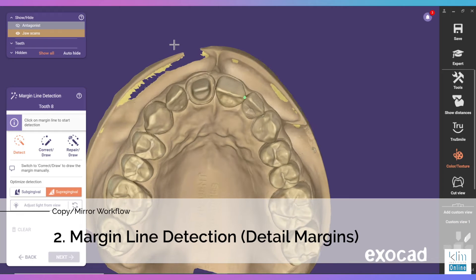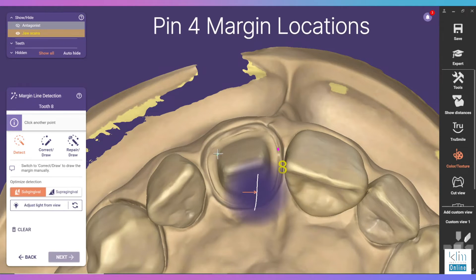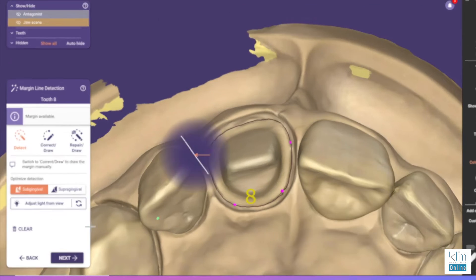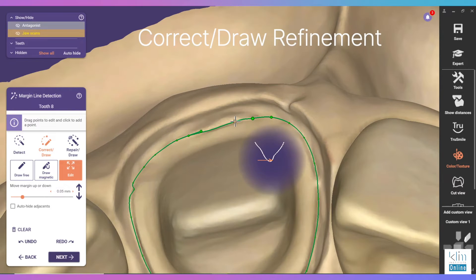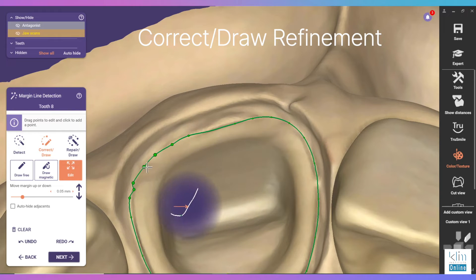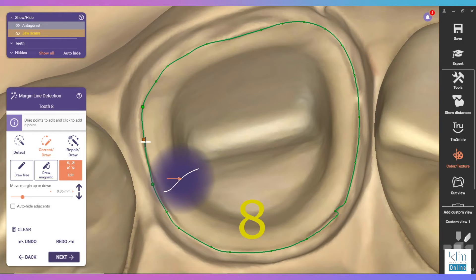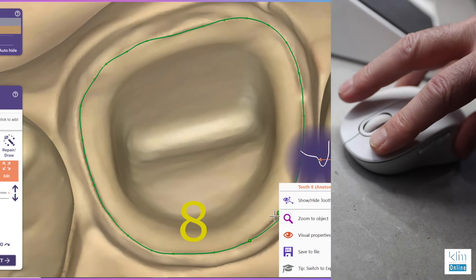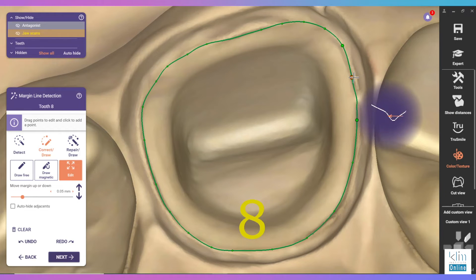Detecting the margin line is fairly simple in ExoCAD. If there's a well-distinguished line you can use the detect feature. Four points on that will outline the margin fairly well and then we can go back and correct. I usually find I like to remove some of those little pinned areas, and that happens by holding down the left mouse and clicking on the right mouse — you can erase some of those pinned views to streamline your drawing on the margins.